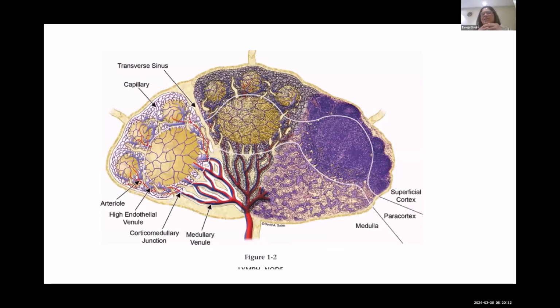The lymph node as a structure is not just a mass of lymphoid tissue. If you read normal histology, it's amazing that it's a ball of cells that has definite traffic control. That means you see these compartments. It is divided into the germinal centers, the paracortical compartment, and the medulla. In each of these, the flow is not passive.